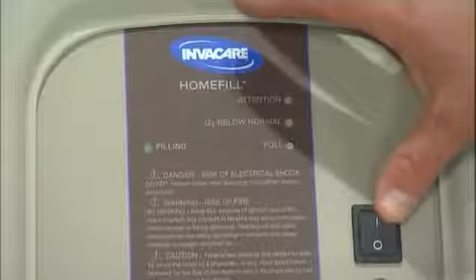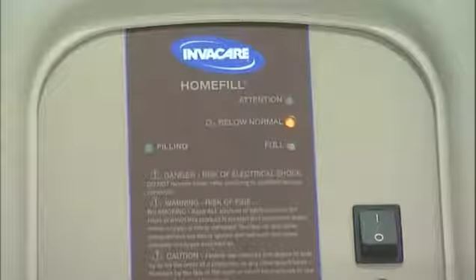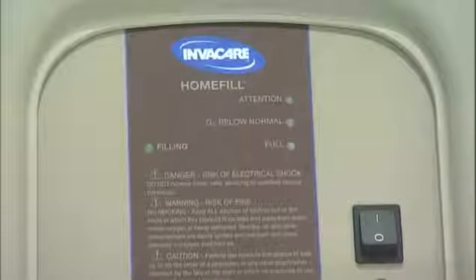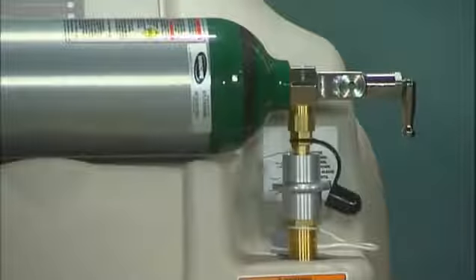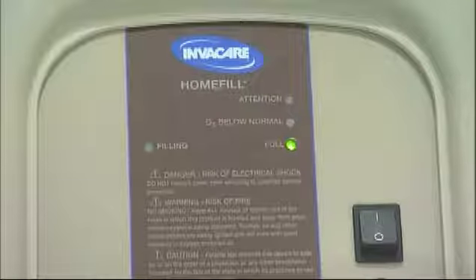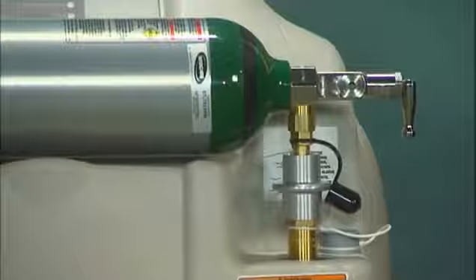Turn the home fill compressor on to begin filling the cylinder. When you first turn the home fill unit on, the oxygen below normal light will light up for the first three minutes or so while the home fill unit is warming up. The light will turn off when the home fill is warmed up and ready to fill a cylinder. The filling light will remain lit while the home fill is filling your cylinder. When your cylinder is full, the full light will come on and the home fill compressor will automatically shut down.